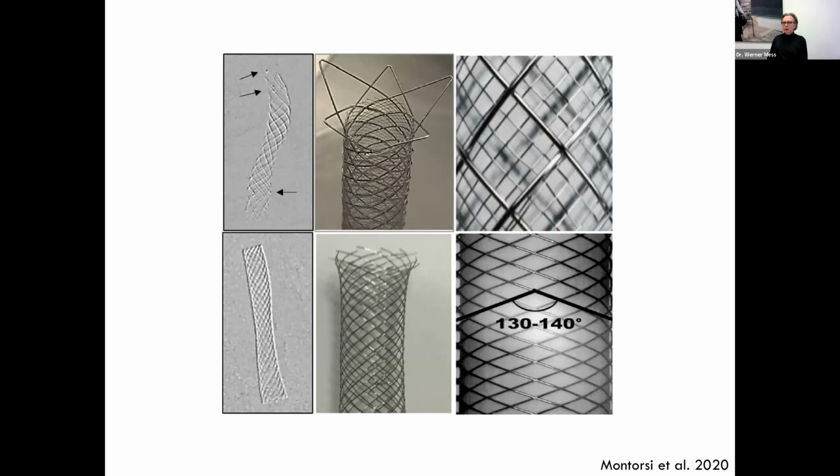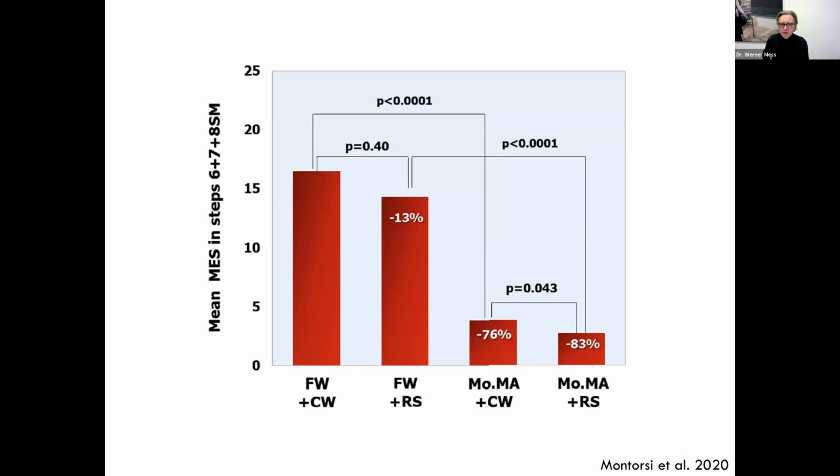Now this brings me to the last topic, the last application cluster or field, and that is monitoring or adjusting therapy when it comes to invasive therapy. These are carotid artery stents, and the one above is a relatively new type. It's called Roadsaver. And the authors checked whether using the new type would result in fewer emboli. And of course, the idea is that the emboli serve as a surrogate marker, and the fewer emboli you produce, the better for the patient.